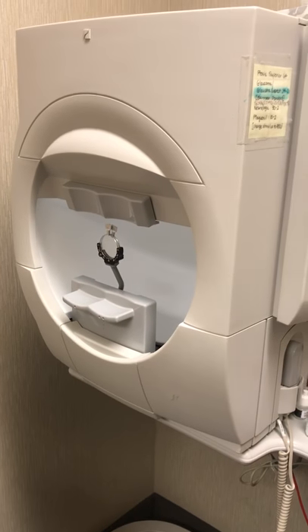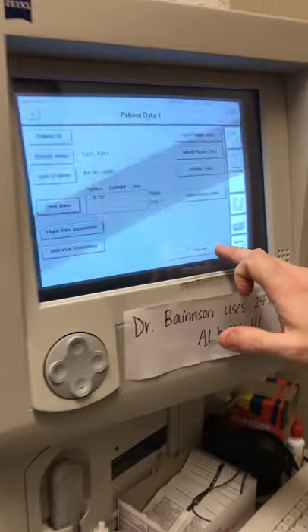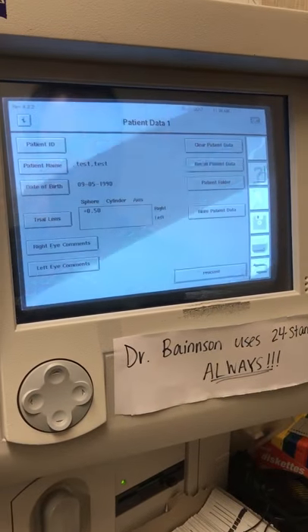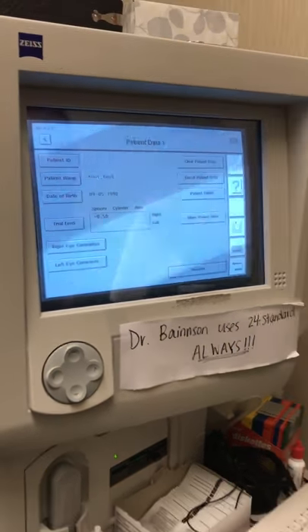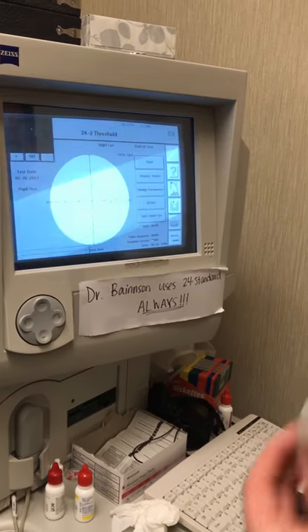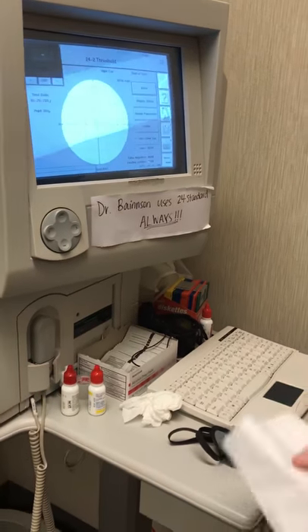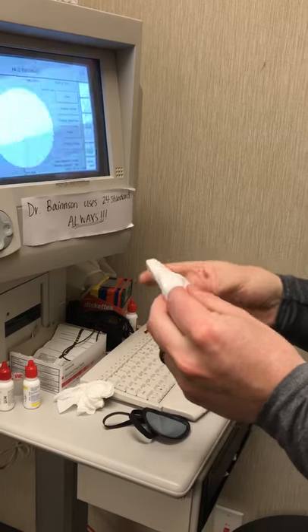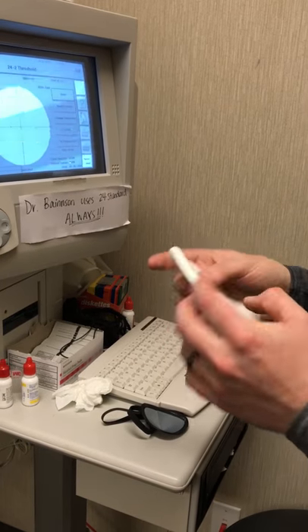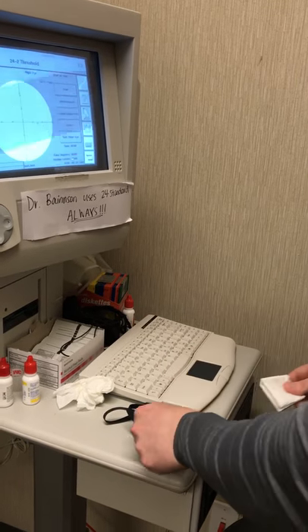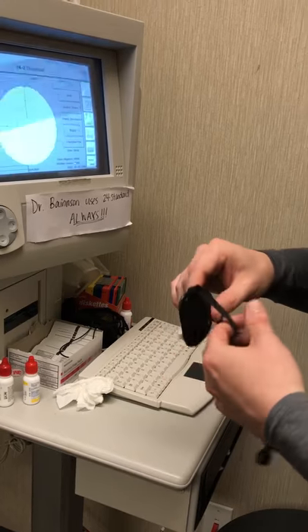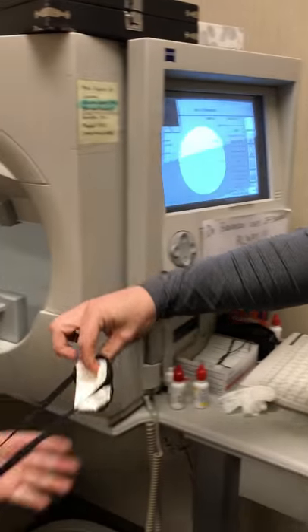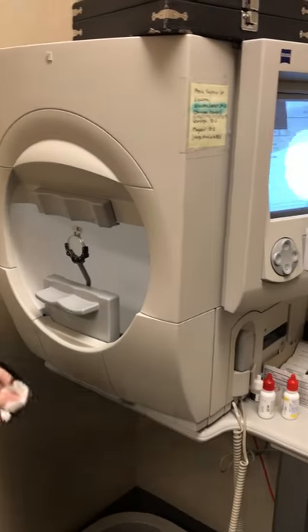After that's all set up, we're going to hit Proceed on the screen here. We're going to give her an eye patch, so we're going to patch one eye at a time to see how their peripheral vision is for each eye independently. You can cover your left eye first, so we'll do the right eye.